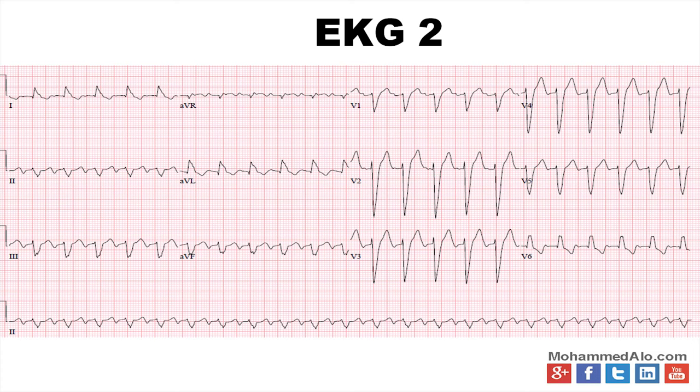So the question in these cases is always, what is this? Is it a sinus rhythm or an atrial tachycardia? Is it a ventricular tachycardia? Well, just looking at it carefully, you do see that sawtooth pattern. It may be that the patient went into an atrial flutter, given that they have that left bundle branch block. That's why it looks that way.